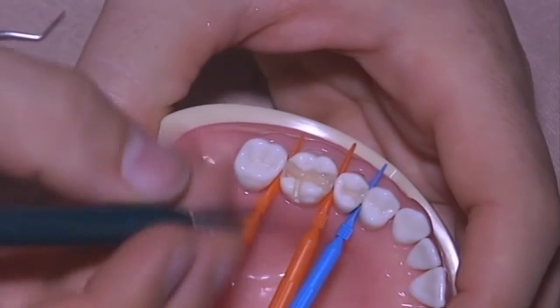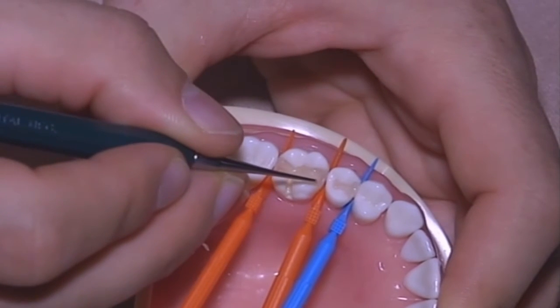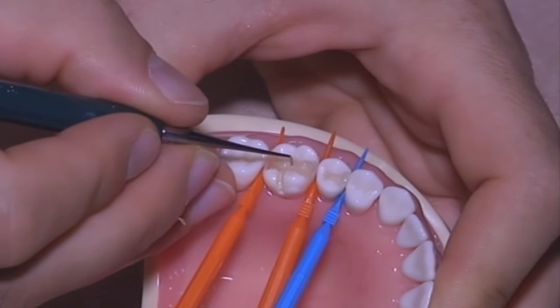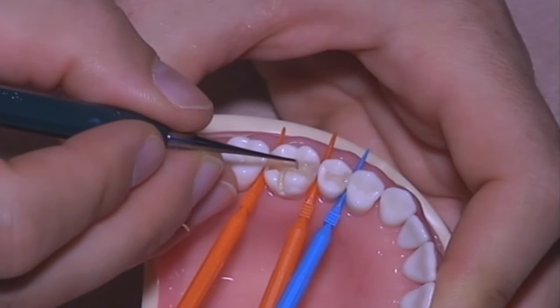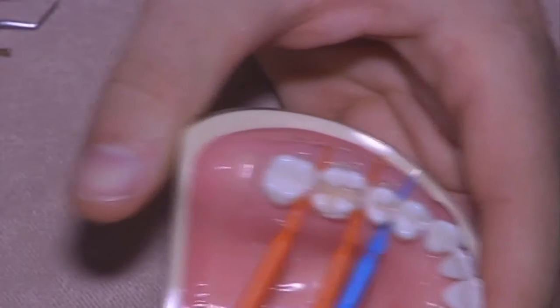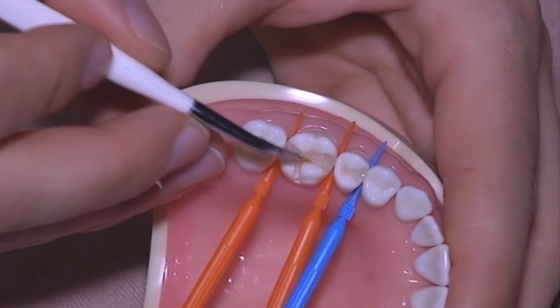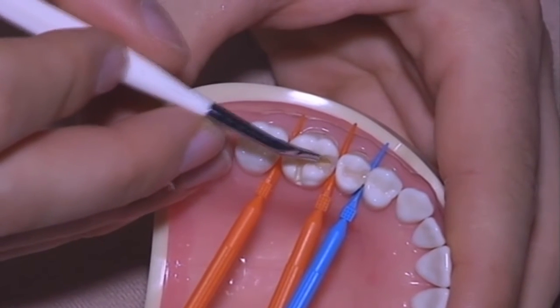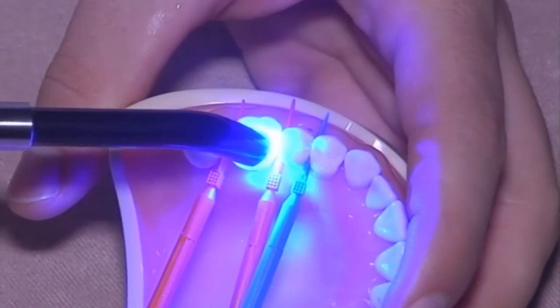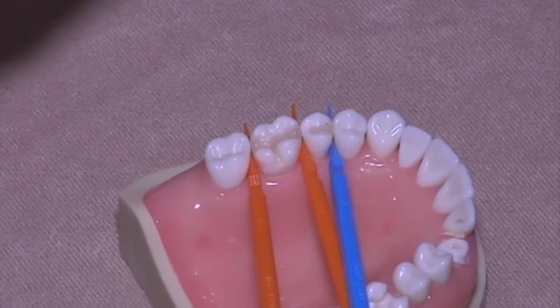And then with little points, beginning to give the anatomy. Here we are. And now, last dentin layer.